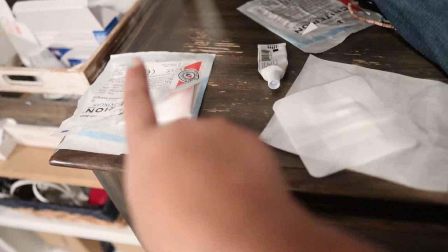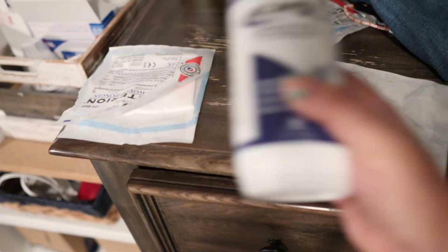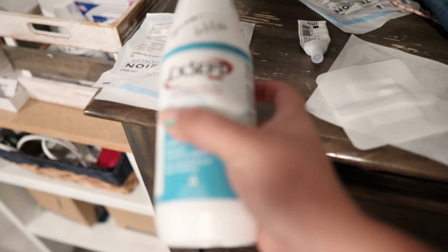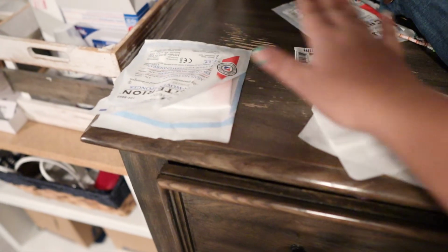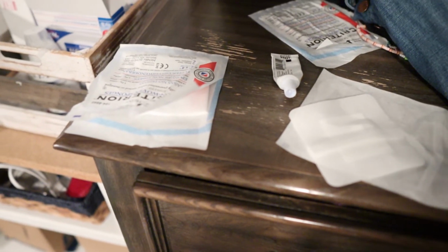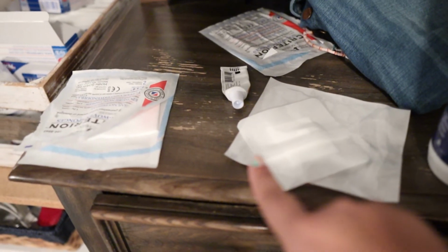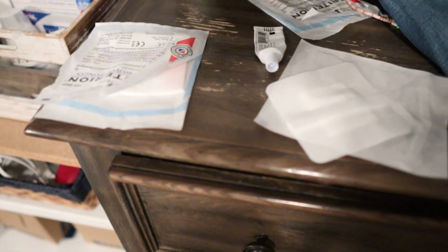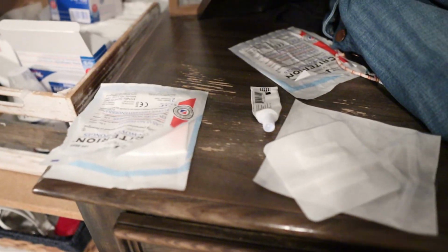Like, we need some gauze soaked in this solution, and that's what we use to clean the catheter before we connect, or before he connects to it. And then we use a different solution to actually clean the insertion site where the catheter goes into his belly. So I just go ahead and get both of those soaked, so that they're ready to go when he's ready to connect. And then sometimes we'll go ahead and get his bandages changed out too. He does an antibiotic ointment cream and changes out the bandage on that insertion site where the catheter is. So we'll do that while the machine is priming and just try to save time that way. But this also has to get done every single night.